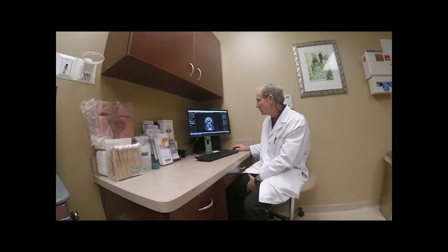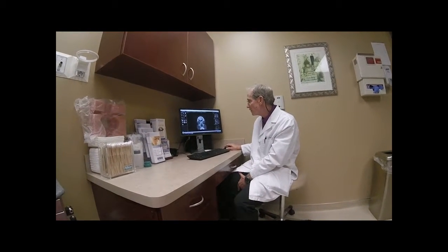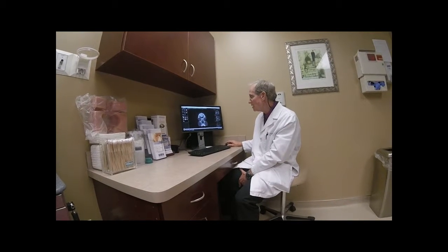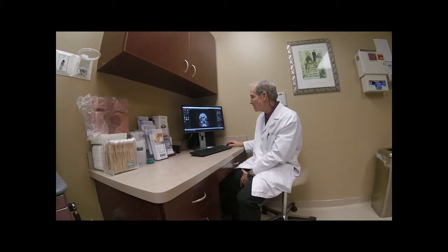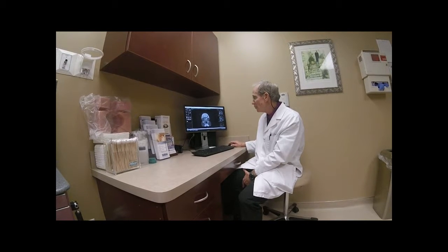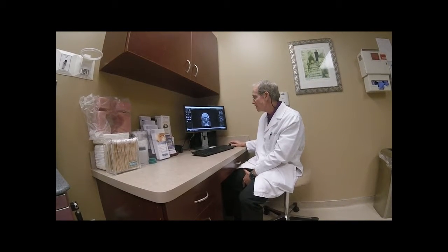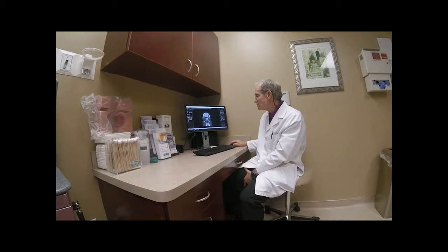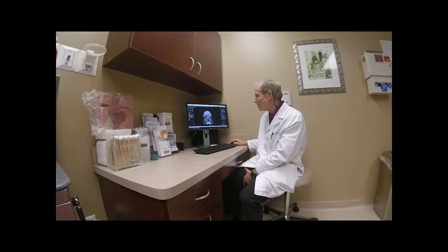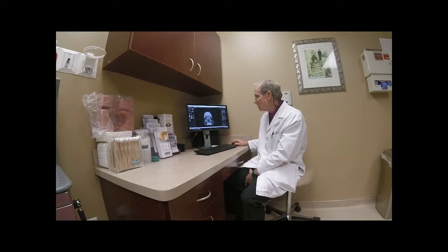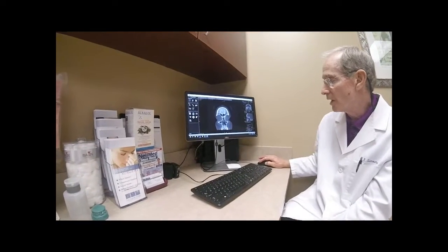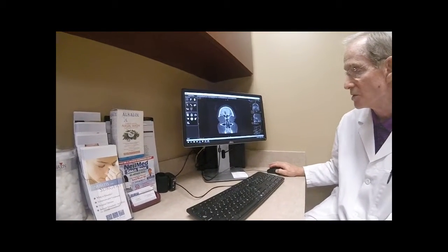We're moving further back and so far we haven't found any significant abnormalities. The frontal sinuses have a communicating drainage duct that comes from the bottom of the sinus and enters into the nose, which we will pick up later. The brain sits just above these sinuses. The maxillary sinuses are beginning to show up here, and immediately we see that in this right maxillary sinus there is a halo of light gray color around the perimeter, indicating swelling of the mucous membrane.